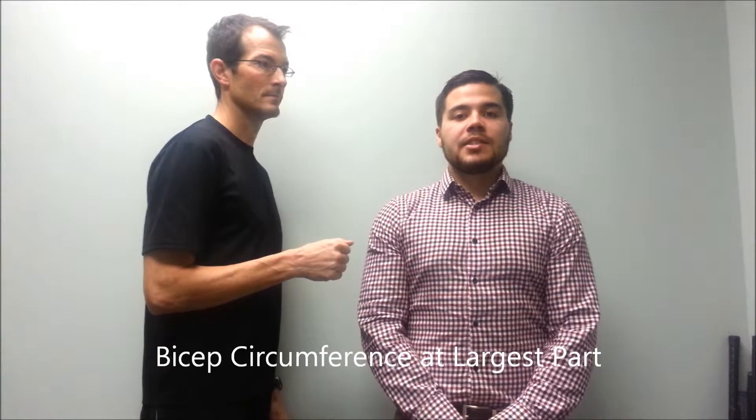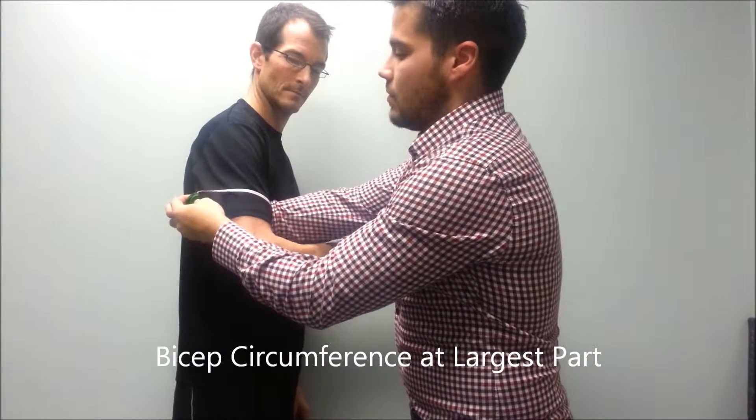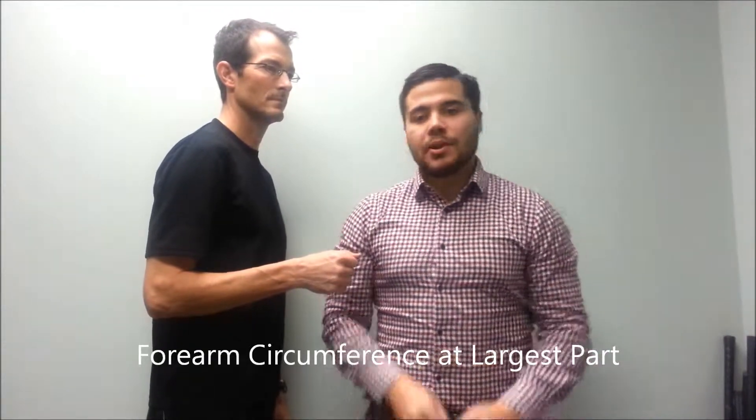Our first measurement is a bicep circumference at the largest part. Our next measurement is a forearm circumference at the largest part.